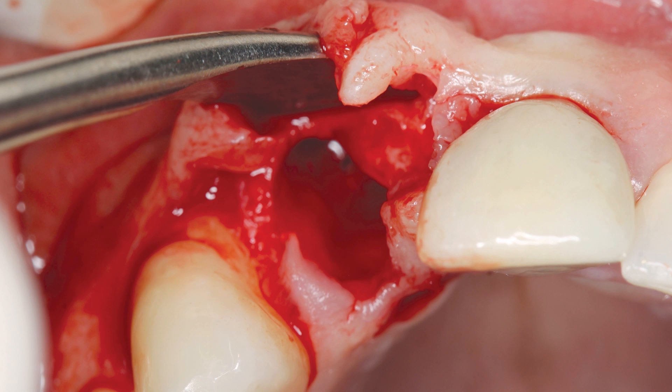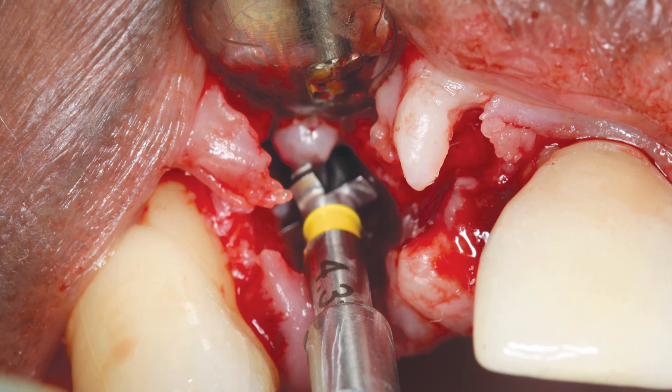It was determined that the site would be prepared for immediate implant placement. An osteotomy was created for a 4.3 millimeter by 11.5 millimeter Hahn tapered implant. A 2.4 millimeter pilot drill was used to create the initial osteotomy, about 3 millimeters palatal to the facial aspect of the adjacent crowns, and about 3 millimeters deeper than the cemental enamel junction of the adjacent roots. To avoid the risk of perforating the relatively thin facial bone, the osteotomy was created without following the path of the extraction socket, and a 4.3 millimeter by 15 millimeter surgical drill was used to create the final preparation, extending beyond the apex of the socket.